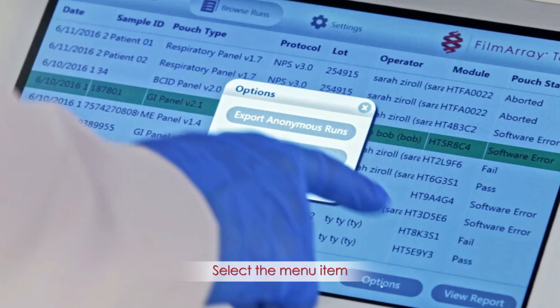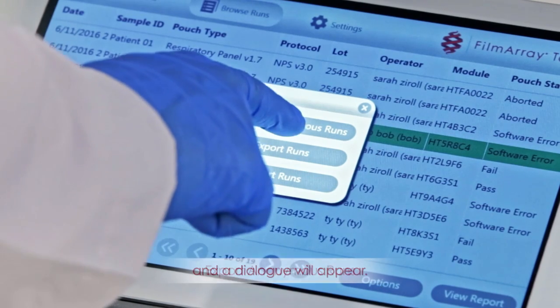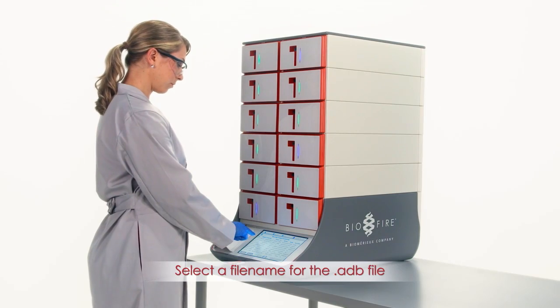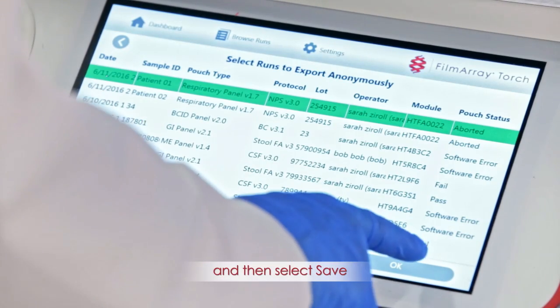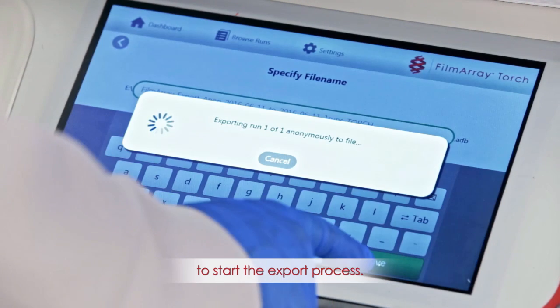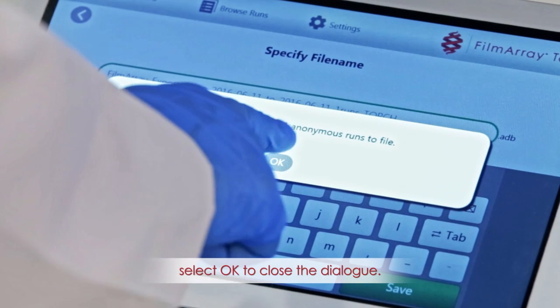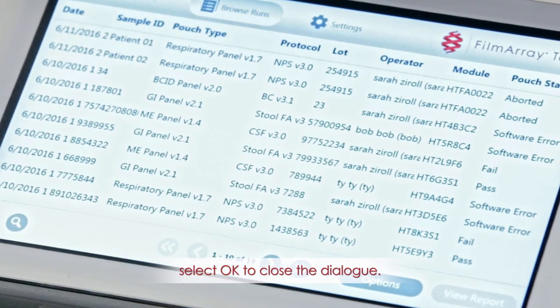Select the menu item Export Anonymous Runs and a dialog will appear. Select a file name for the .adb file and then select Save to start the export process. During the export process, the Export Anonymous Runs dialog will display the progress of the runs being exported. When the export is complete, select OK to close the dialog.